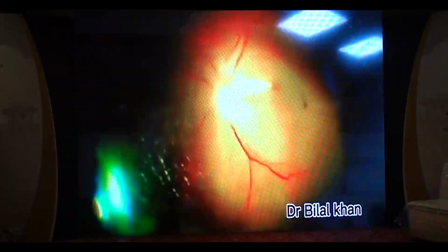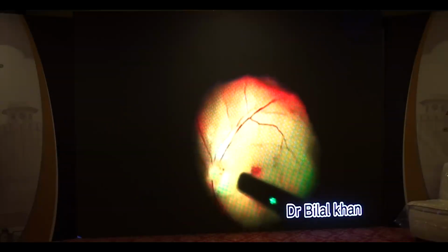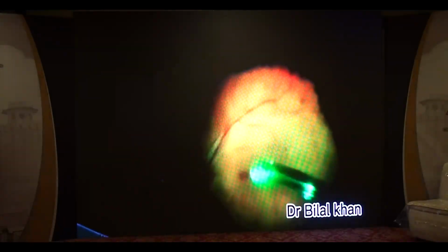PVD has been done. Here peripheral vitrectomy is going on. That is macular hole in detached retina.